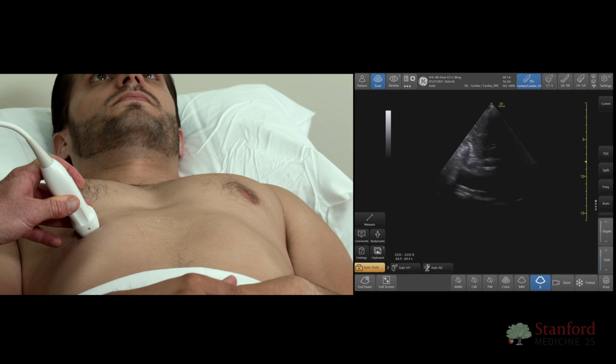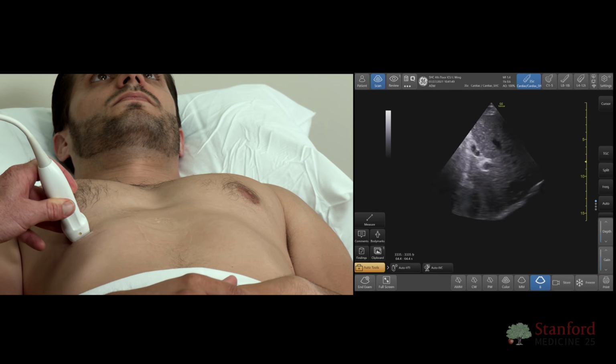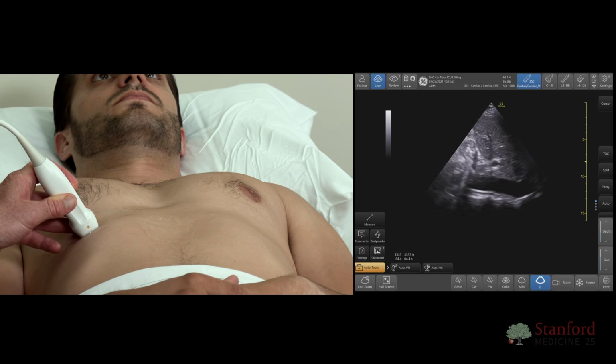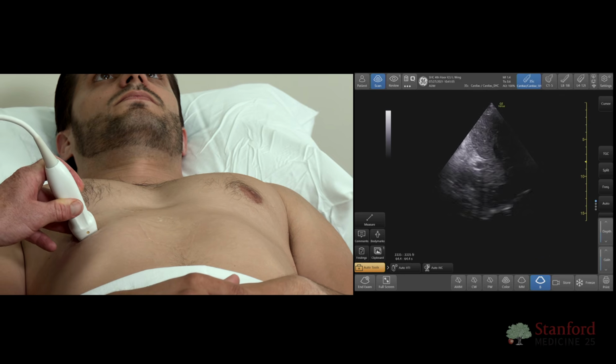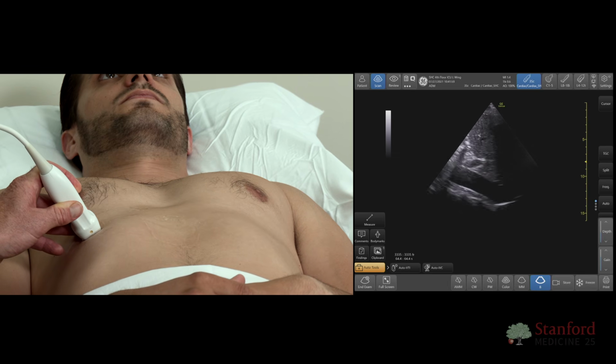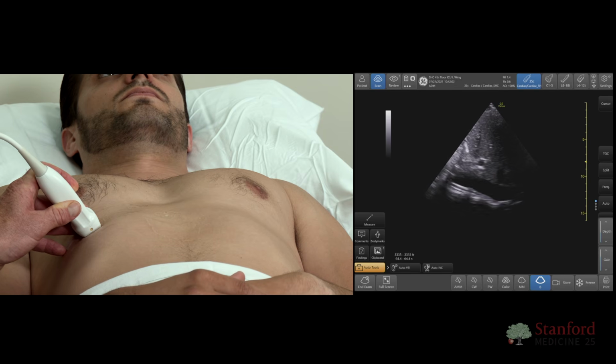Can I see farther up into the chest? And notice to do this, I'm rocking that probe again, okay? I'm rocking the probe to send the beam up into the chest. And there's our IVC, and I'm rocking it in, and now I can just see the hepatic vein entering right there at the edge of my screen. I've got a little bit of lung that keeps trying to get in my way, but I can see the hepatic vein entering there. I should be able to take a good measurement.